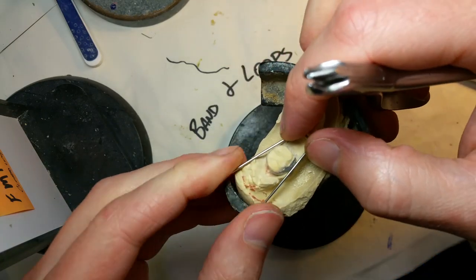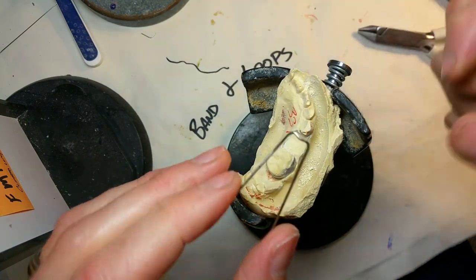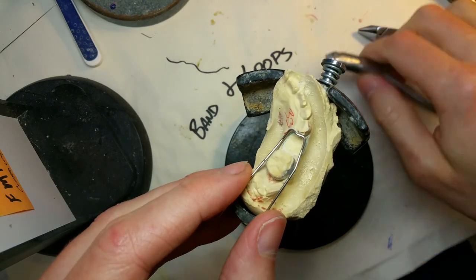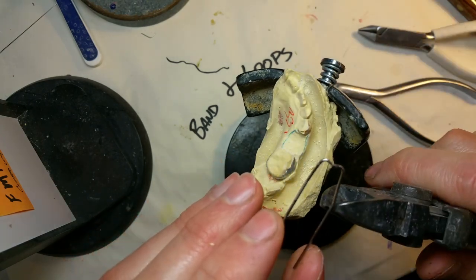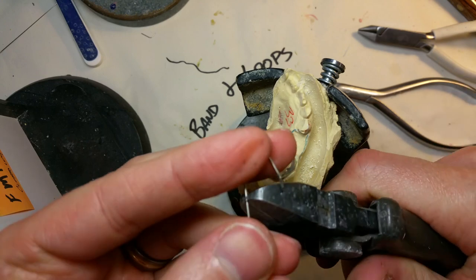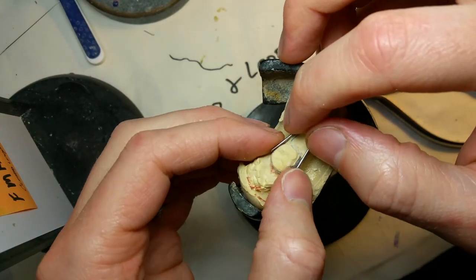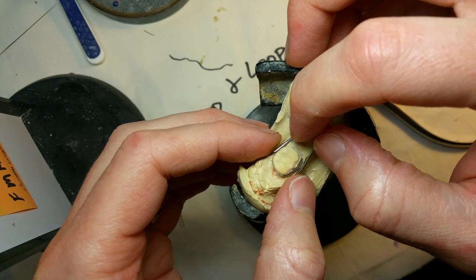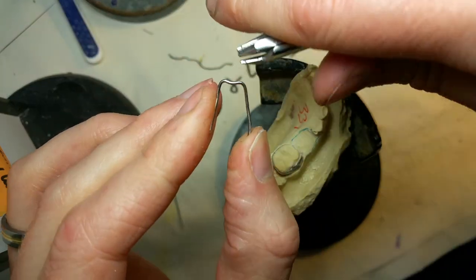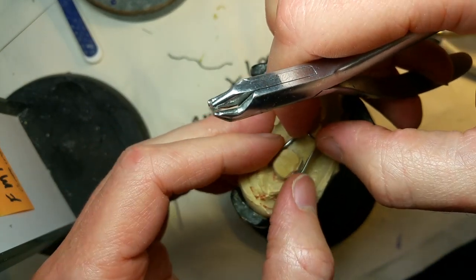This is a space maintainer. It is designed just to hold space. A kid has lost their tooth or has to have it pulled too soon. When that happens, the adjacent abutment teeth tend to drift toward each other. If there's not a tooth there to hold them back, they'll lose that space, and there won't be enough room for the bicuspid to erupt into — they'd need major braces work to open up that space.